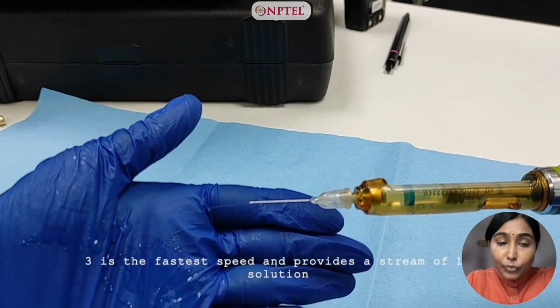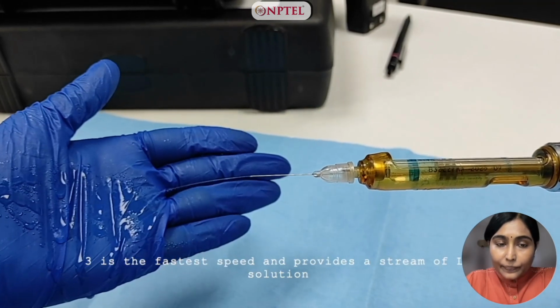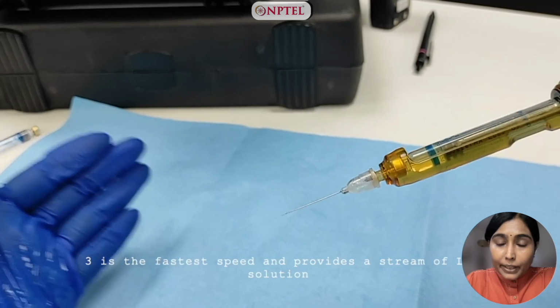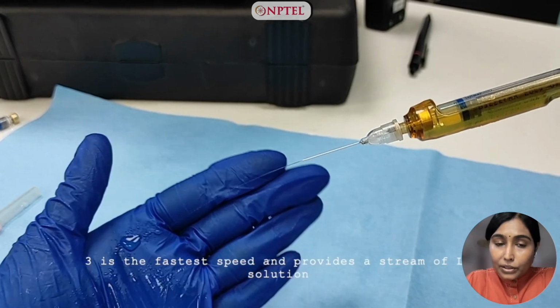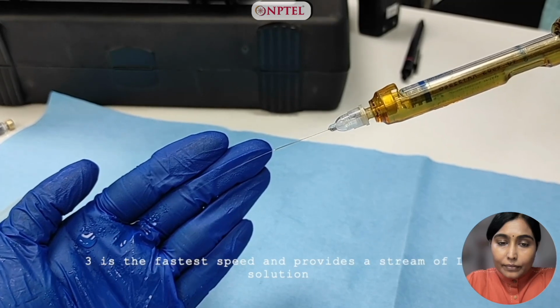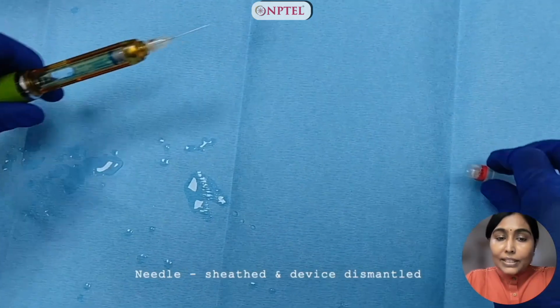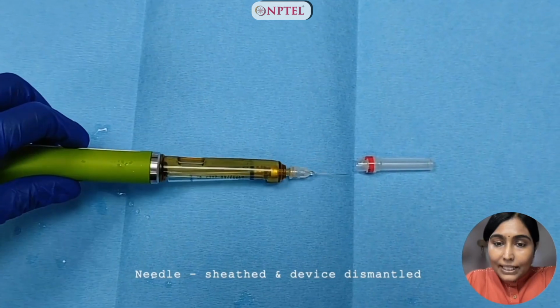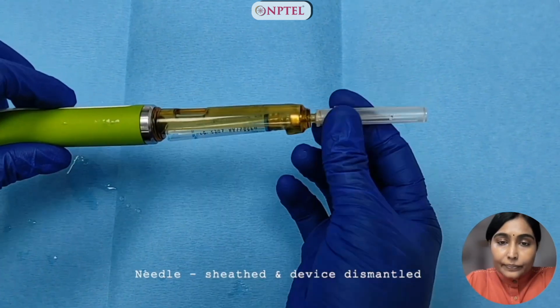So this is how we modify the rate of local anesthetic solution with a pen grasp. It is ergonomic because we are using the pen grasp as we insert the syringe into the tissues of the patient, and we are able to control the speed of local anesthetic delivery. Once the procedure is completed, the needle is sheathed and we are ready to dismantle the device.